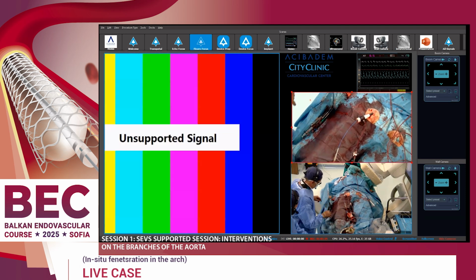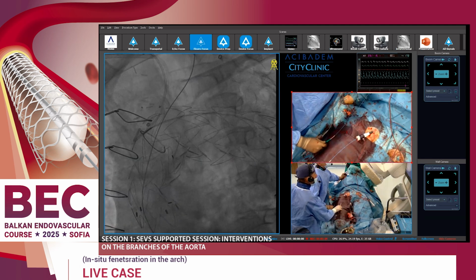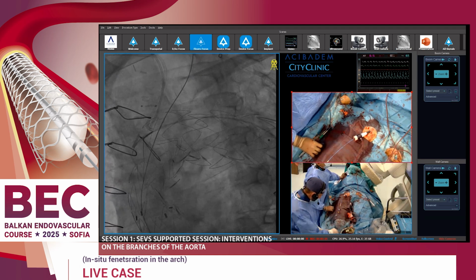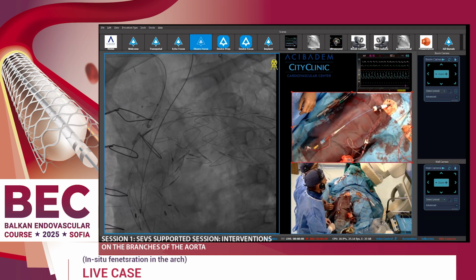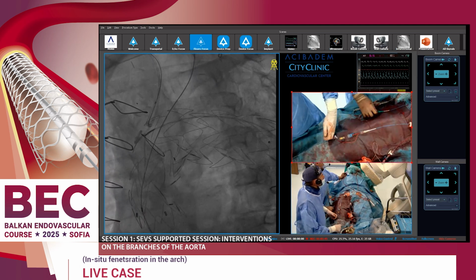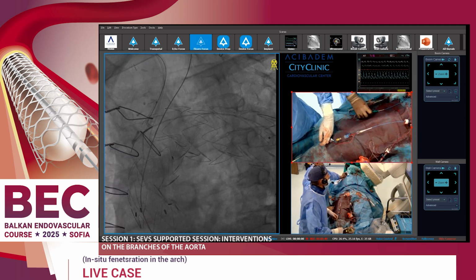No. It's again a side. Ah. So now it's much better. It's probably just touch it without push. Just touch. Touch.